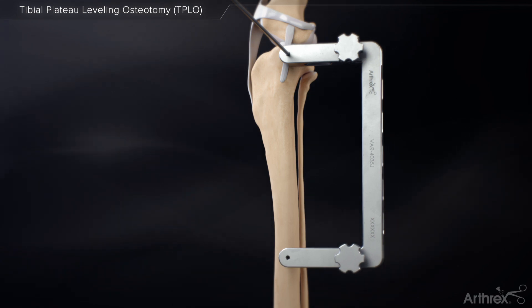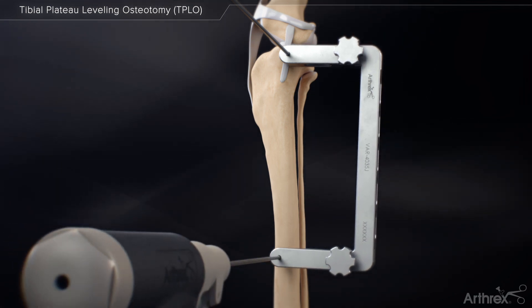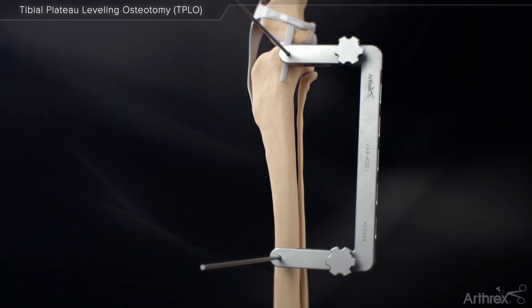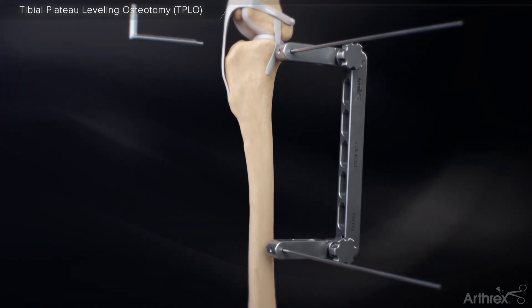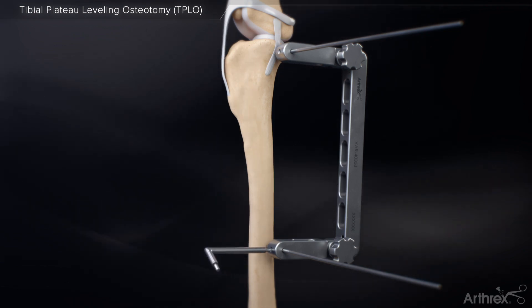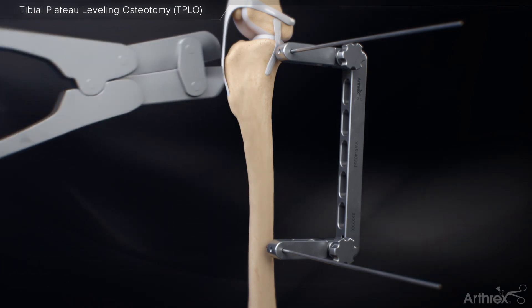Place a second jig pin through the distal jig pin hole in the arm of the jig. The jig pin should be inserted parallel to the proximal jig pin and centered in the tibia. Tighten both jig pin screws and cut the proximal jig pin allowing 6 to 8 millimeters above the jig.